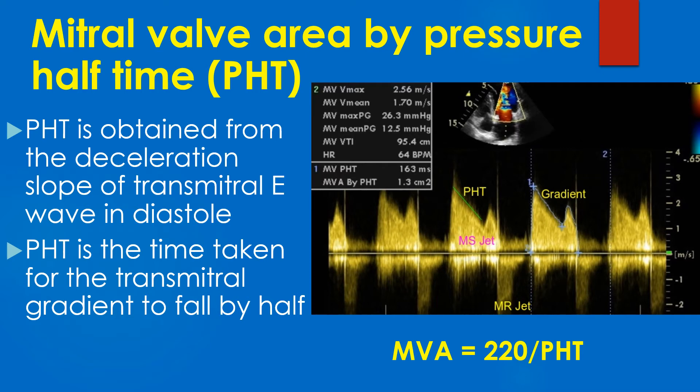In mitral stenosis there is no diastasis. The E wave merges with the A wave, or there is E-A fusion. The green cursor measures the PHT of the mitral stenosis jet.